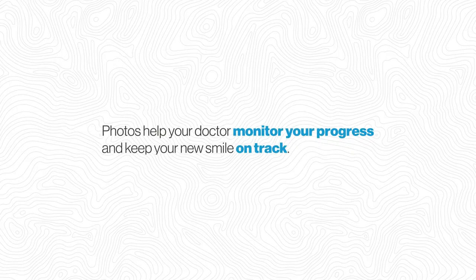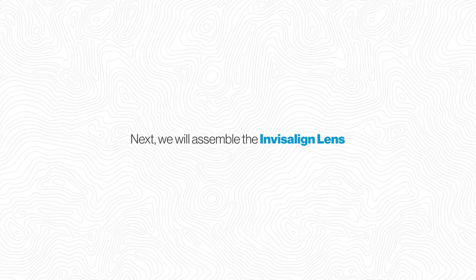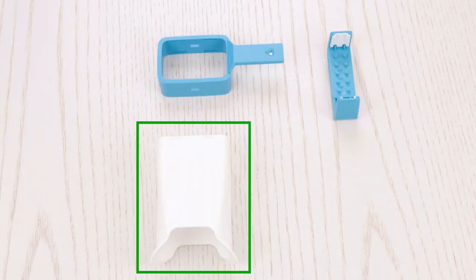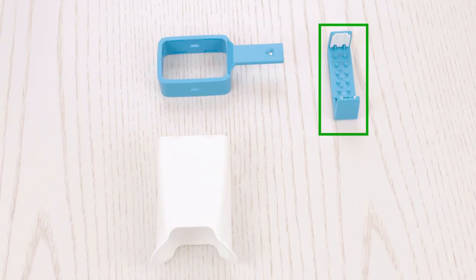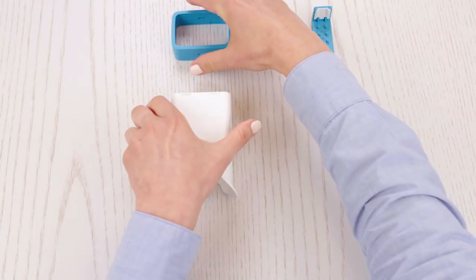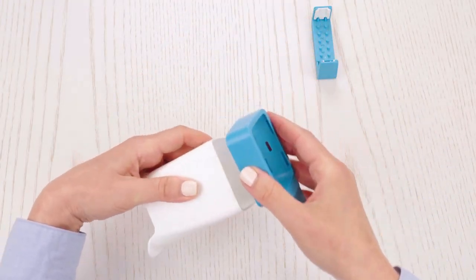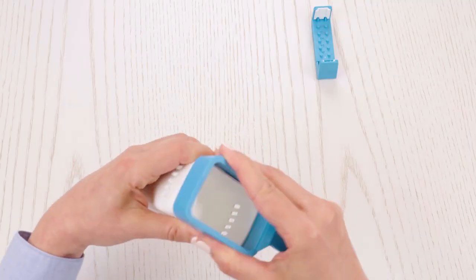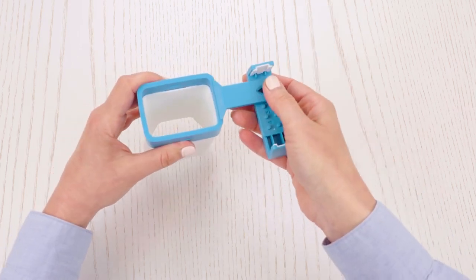Next, we will assemble the Invisalign lens, which consists of 3 parts: the photo lens, the frame, and a slider. Step 1. Connect the frame to the lens and snap it in place. Step 2. Connect the frame to the slider.